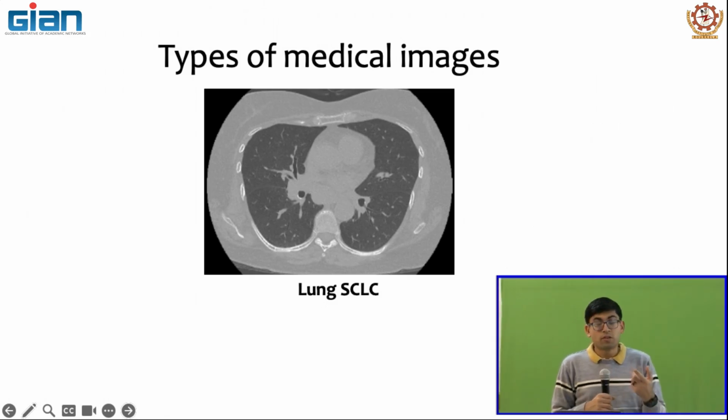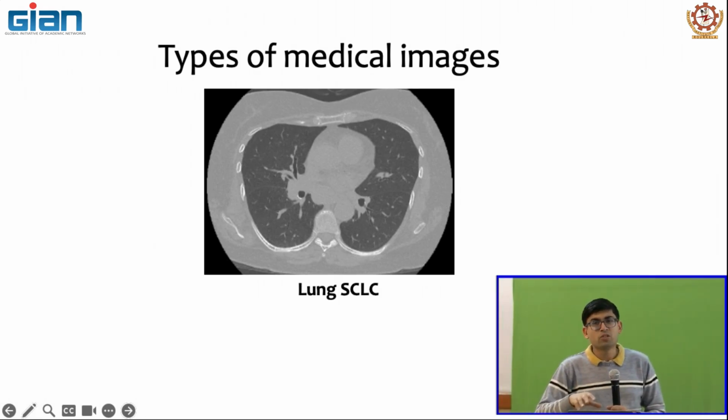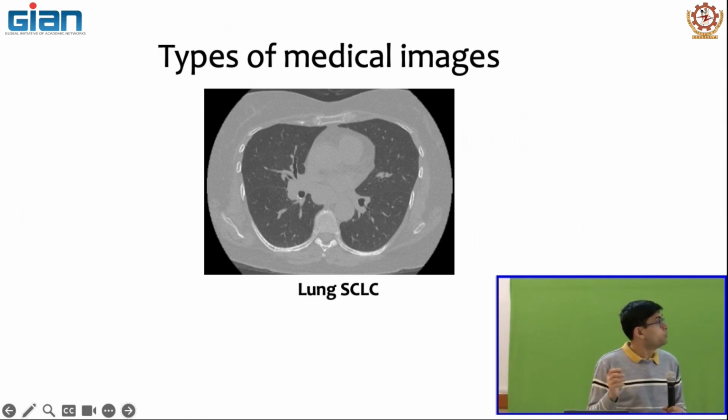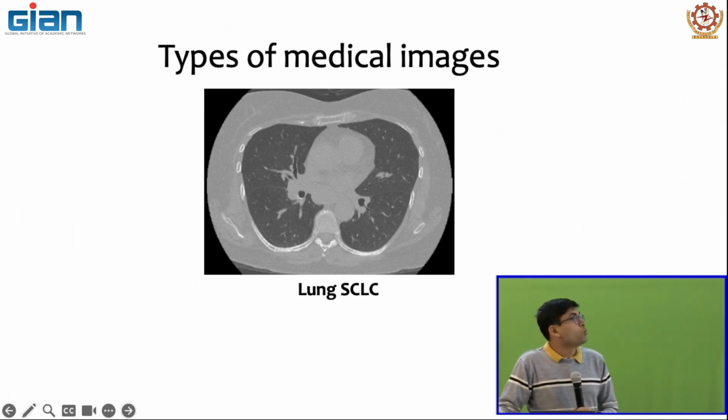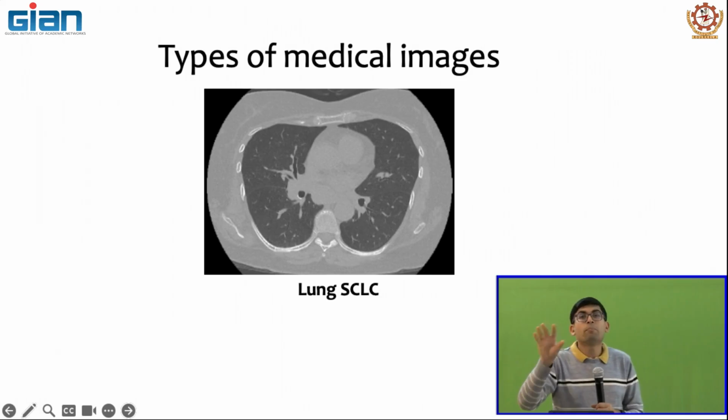There is a software called 3D Slicer. There are other software like ITK Snap. I don't think we'll need you to download this software right now. We already have that on our machine, so you can see how to work with those. Monak will go through software like 3D Slicer in more detail. You'll see how you can not just upload and view images, but these softwares also provide other basic functionalities, such as if you have a tumor, you can upload the mask, or overlay the mask on the image and see where the tumor is, where the boundaries are. You can also do some very basic measurements.